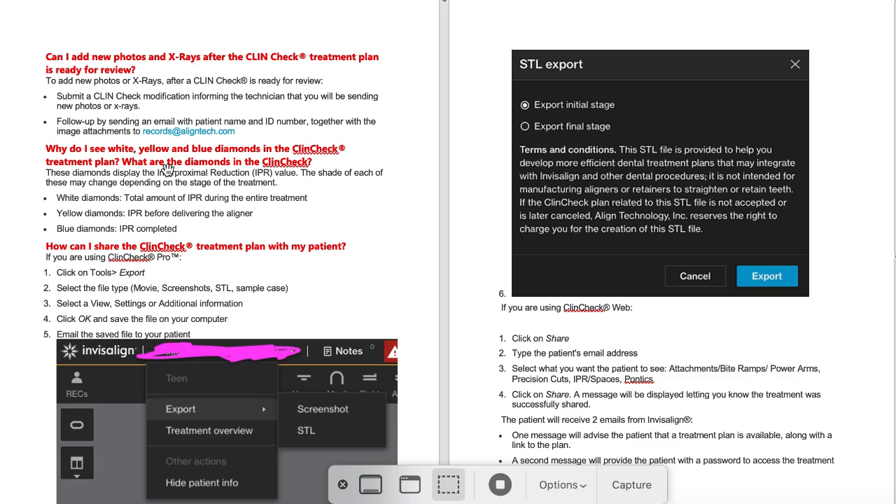Let's talk about the white, yellow, and blue diamonds in your ClinCheck treatment plan that are associated with IPR. I have a lot of videos on how to do IPR — feel free to reach out at straightsmilesolutions.com, they are totally free. Basically, in a nutshell: white diamonds show the total amount of IPR. I believe there shouldn't be any more than 0.5 millimeters cumulative per interproximal space historically, but the software will do way more than that if you don't stop it.